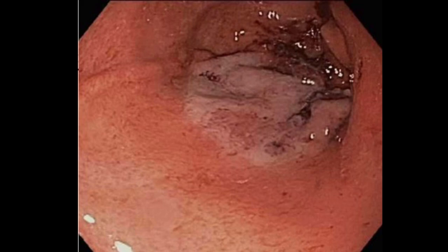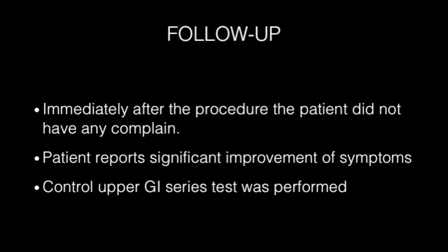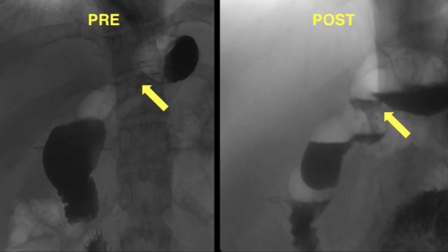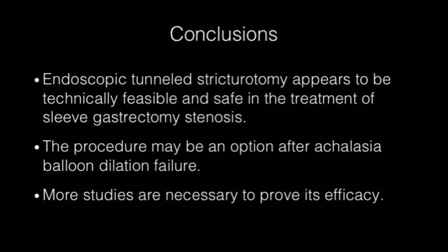After the stricturotomy and closure of the defect, we reevaluated the sleeve. We can now observe an improvement of the stenotic area, as seen in the picture. After the procedure, the patient did not have any complaints. At three months' follow-up, the patient reported significant improvement of symptoms. We performed a post-procedure upper GI series and observed resolution of the stenosis when comparing with the pre-procedure barium swallow. We conclude that endoscopic tunnel stricturotomy appears to be technically feasible and safe in the treatment of sleeve gastrectomy stenosis. The procedure may be an option after Achalasia Balloon Dilation failure. More studies are necessary to prove its efficacy.